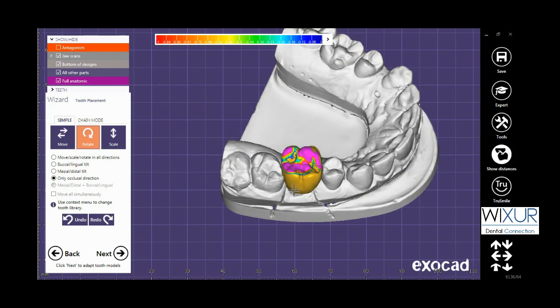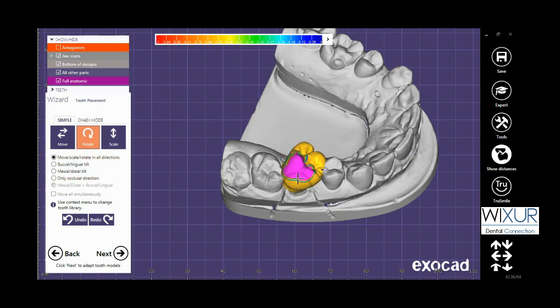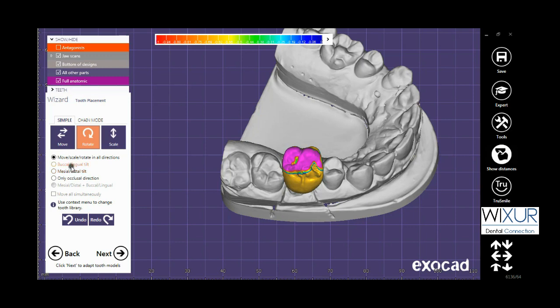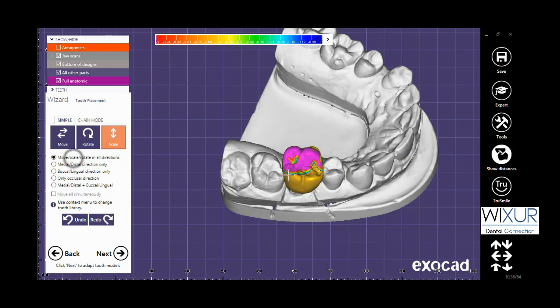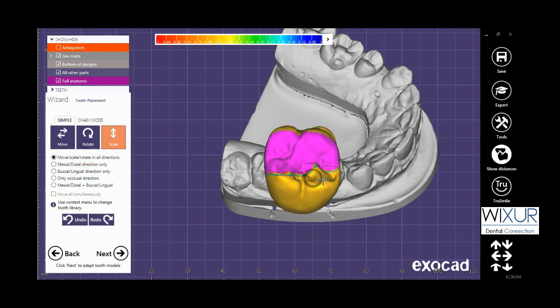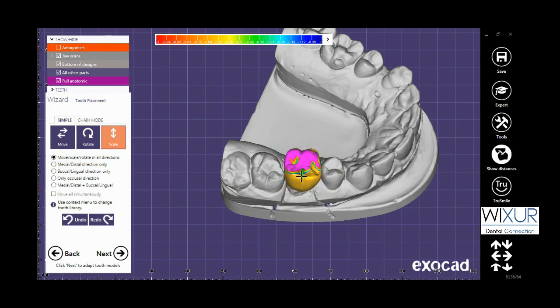For rotate, it is the same. The movement can be limited to a particular direction by checking the circles. The scale is also like move and rotate.